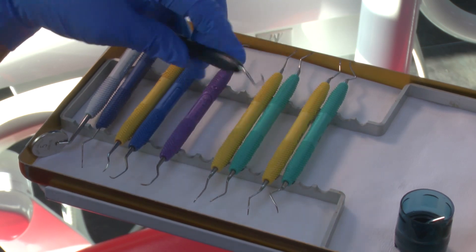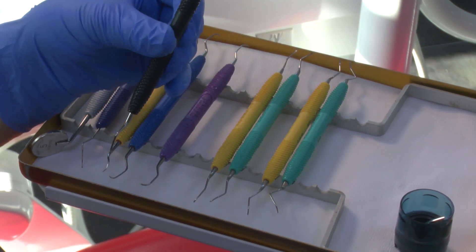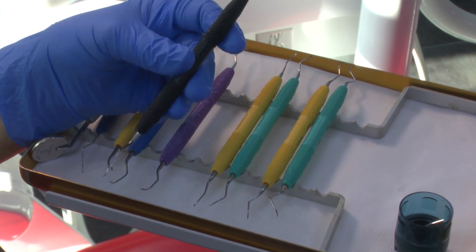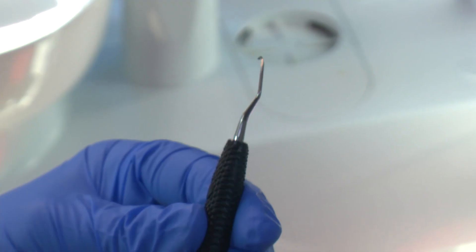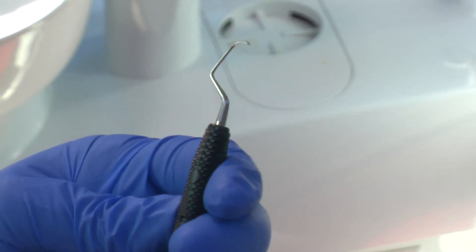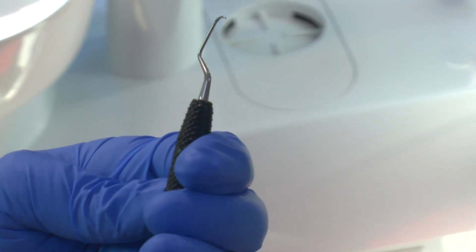This is a Gracey for flat surfaces. Like all Graceys it's bladed on one side, but it's really quite useful for getting into furcation areas. This is a Gracey 9-10.